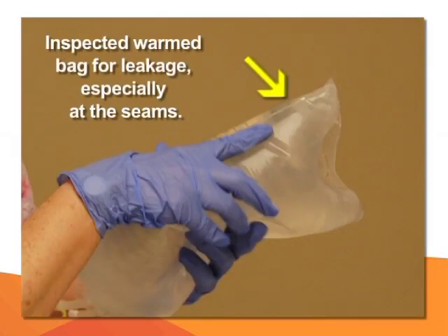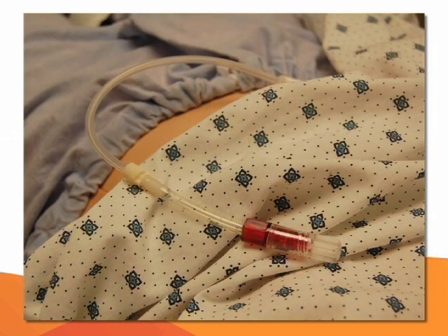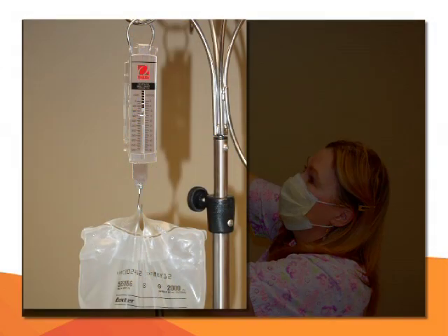Inspect the warm bag, especially the seams, for any leakage, and check the temperature of the bag — it should be tepid to the touch on the inner arm. Ensure the patient's catheter is visible, readily available, and clamped. Note that the patient's catheter may come in different colors.